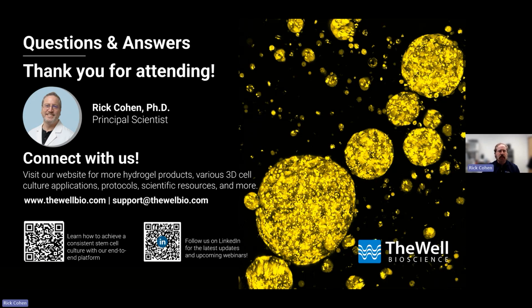The most important thing is, for the weekend-free workflow, 2D or 3D, you put in the lowest amount of cells possible. In 2D, it's really clear. In a 6-well dish, I'll put in around 100,000 cells, maybe 50,000 cells. In 3D, you could put in the 100,000 cells on a Thursday, double up on your media over the weekend, and everything will be fine on Monday. And go ahead and do your alternate day feeding.